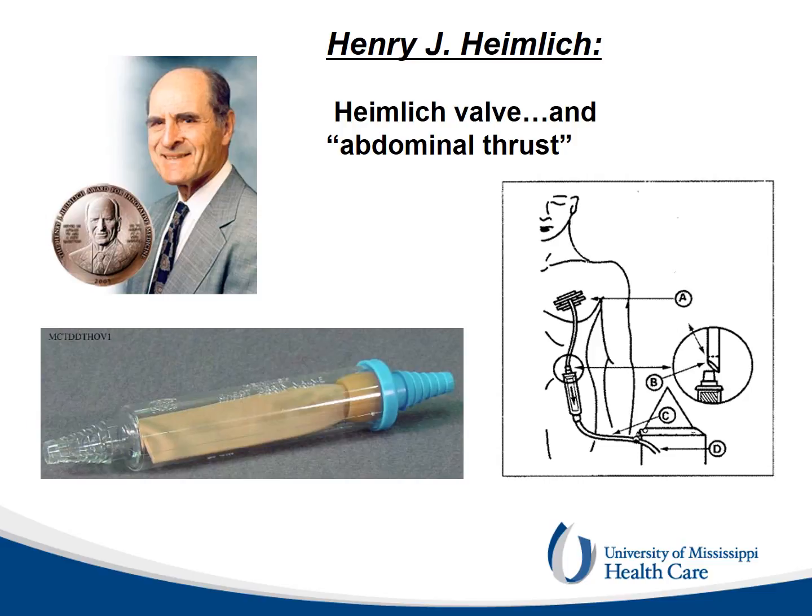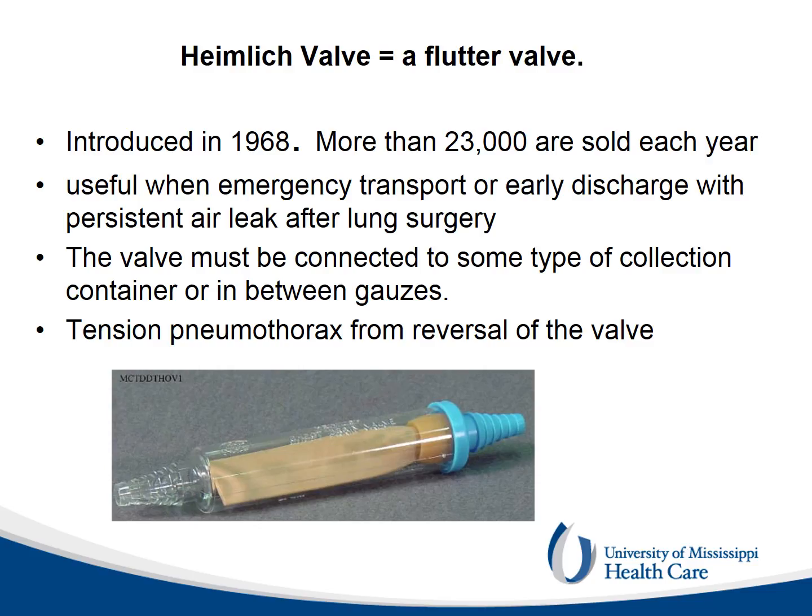Dr. Heimlich invented the unidirectional valve and is also credited for the Heimlich maneuver. The Heimlich valve was introduced in 1968. More than 23,000 are sold each year. It is a flutter valve that opens in only one direction. Therefore, it is important to orient it correctly to prevent a tension pneumothorax.